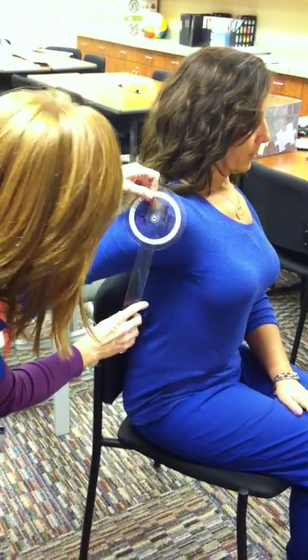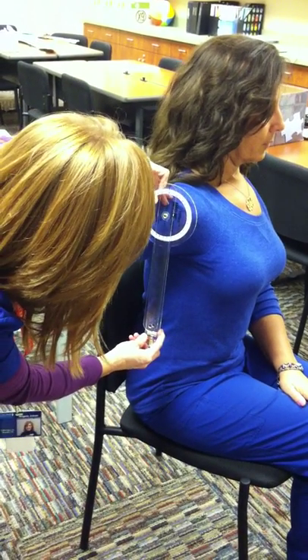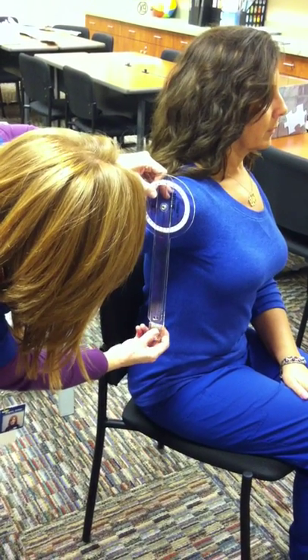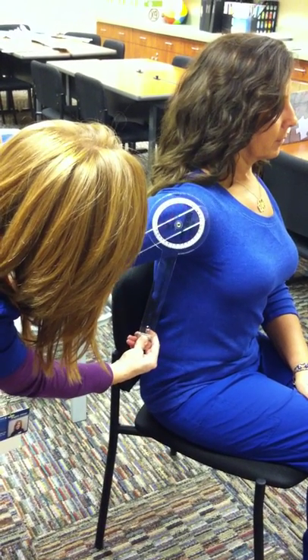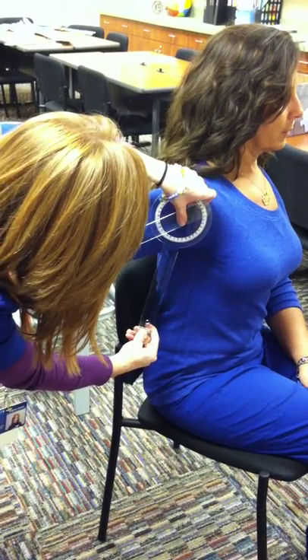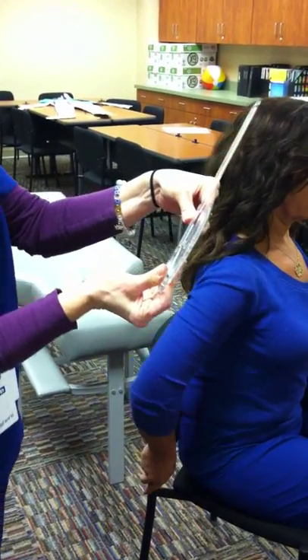Then you take the measurement — you put the axis on the head of the humerus, you make sure that the stationary arm stays parallel to the body, and then you do your movable arm. And it is 51.